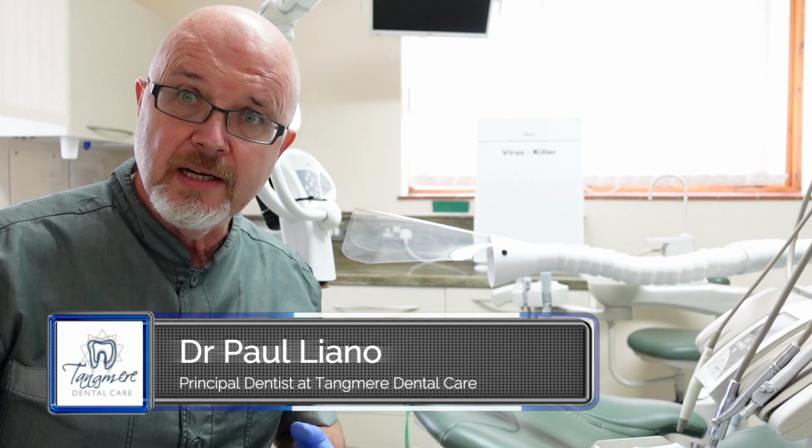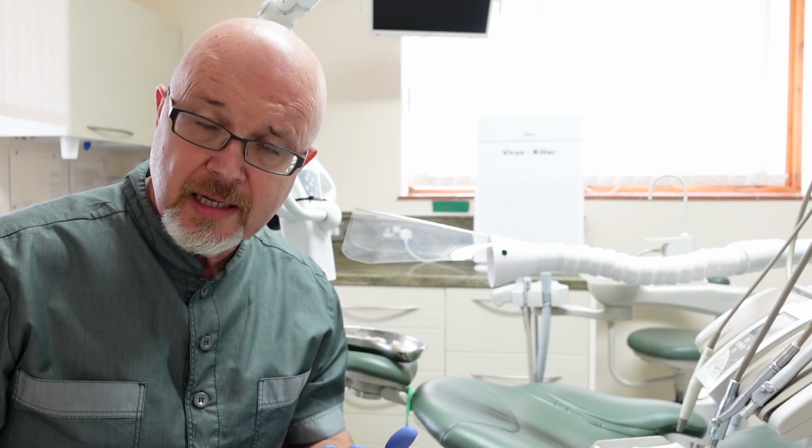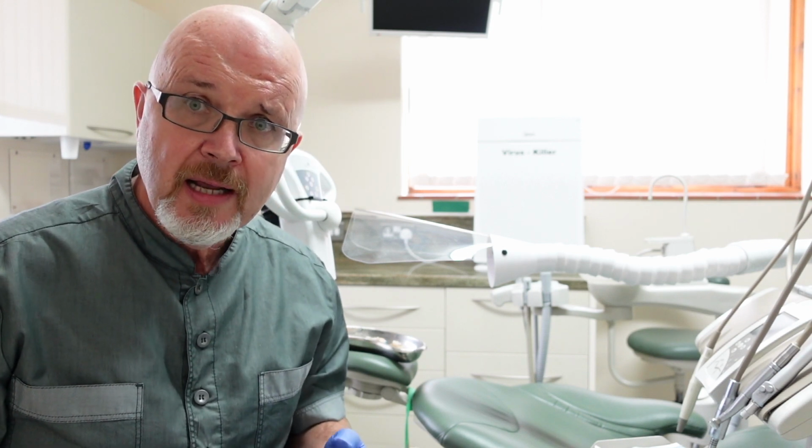Now, I've obviously realised that if we're going to be reducing fallow time, we really need to see what aerosol is produced by actual dental equipment. I did do one video, and I'll put a link up there, which showed that without any mitigation, no open windows, no air filtration, nothing at all, the aerosol produced by an air turbine took around 45 minutes to settle down to normal levels.